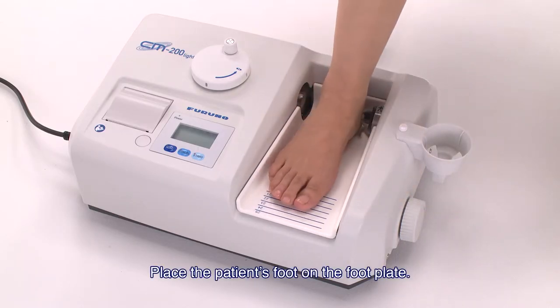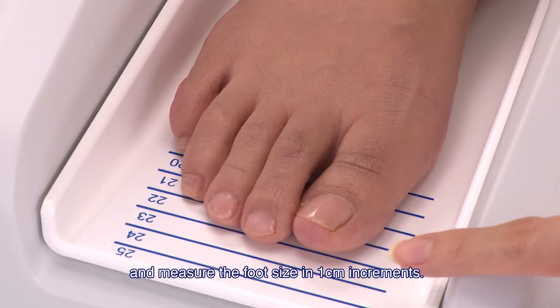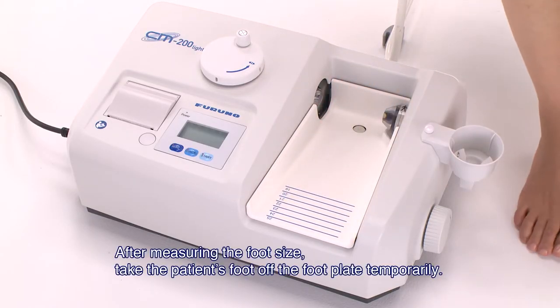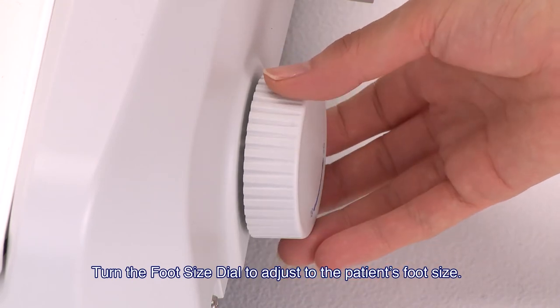Place the patient's foot on the footplate. Set the patient's heel to the rear of the footplate and measure the foot size in 1 cm increments. After measuring the foot size, take the patient's foot off the footplate temporarily.